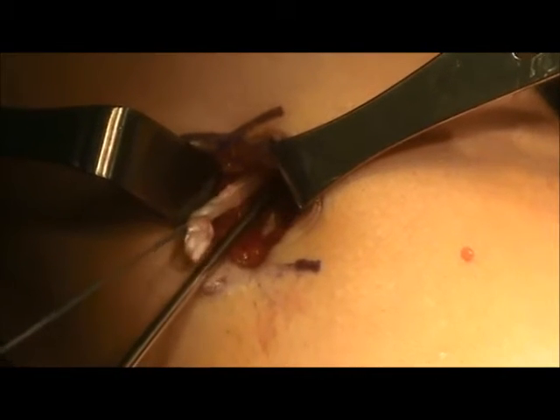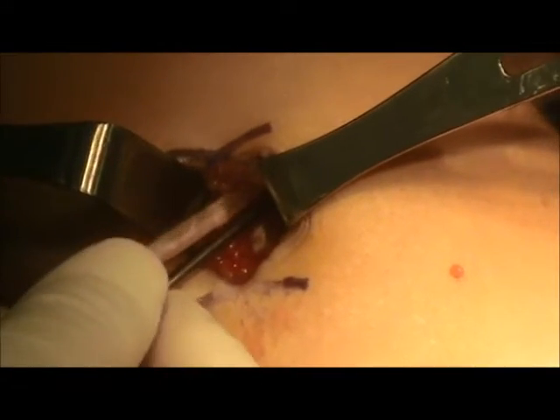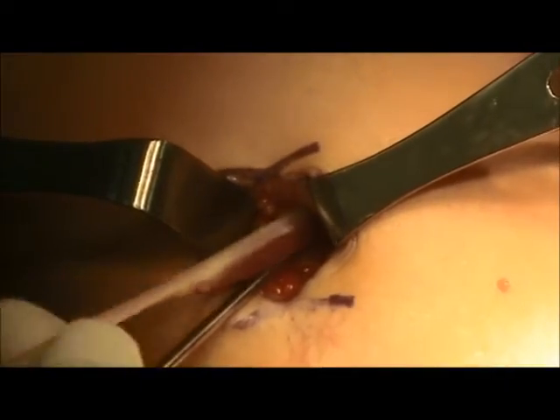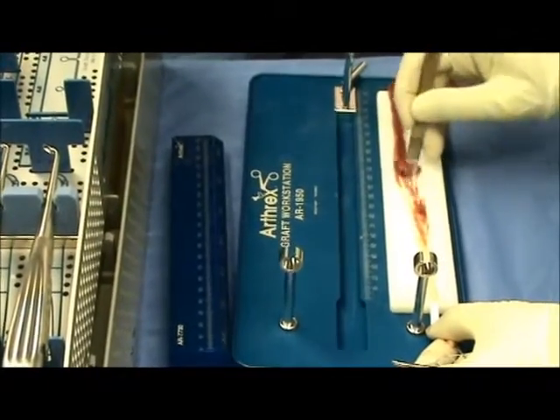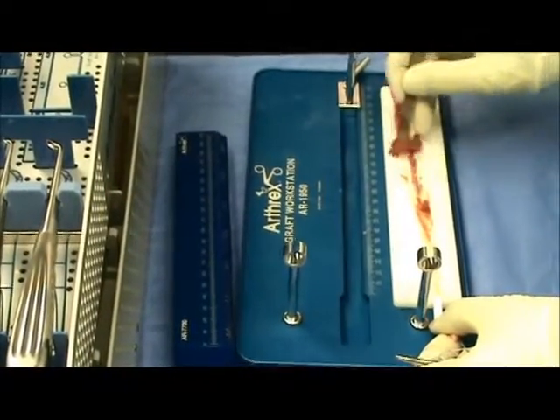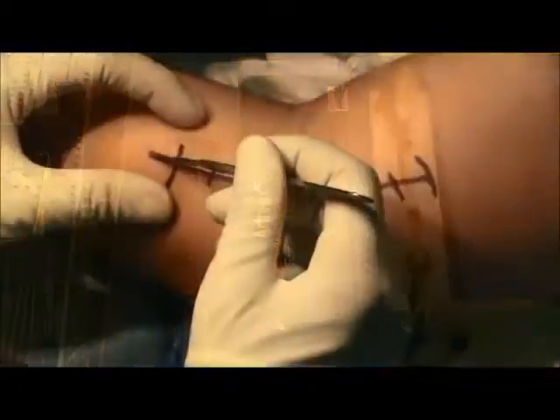A tendon stripper is then used to release the tendon at the musculotendinous junction. Gentle, steady traction is performed while advancing the tendon stripper, allowing release of the tendon. The tendon is then brought to the back table, the muscle is removed, and then the tendon is placed in a moist sponge.